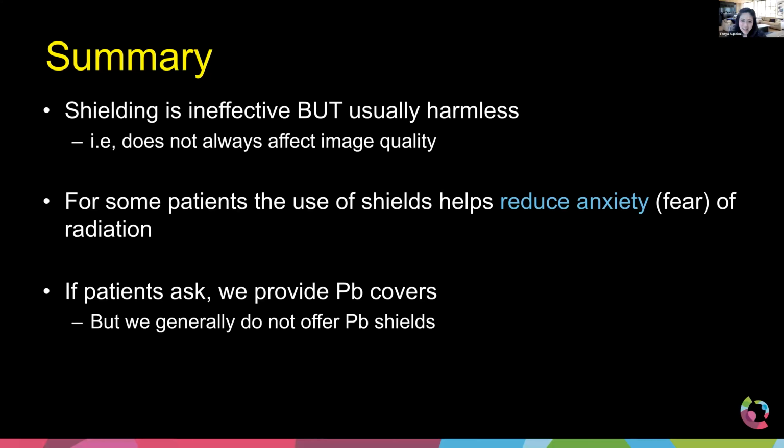Yeah. And one thing that I just learned today is that you have many types of shielding, like the bismuth and the lead apron that we normally use. So which means if we need to use it, does it depend on the body part, or does it depend on the study, the scan, like a CT and radiograph, to choose? So yeah, the majority are lead.